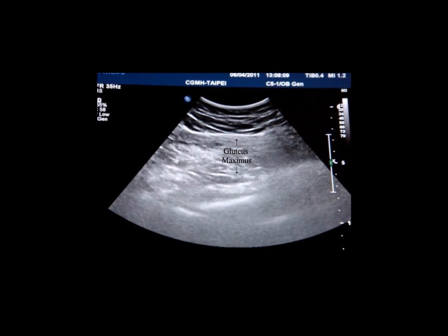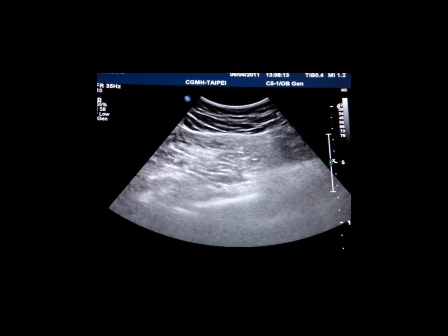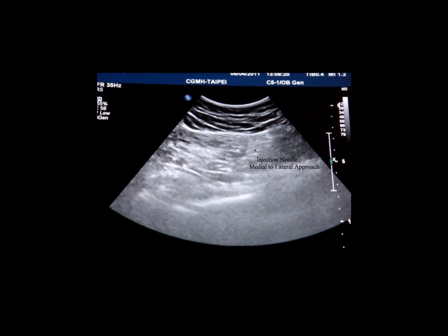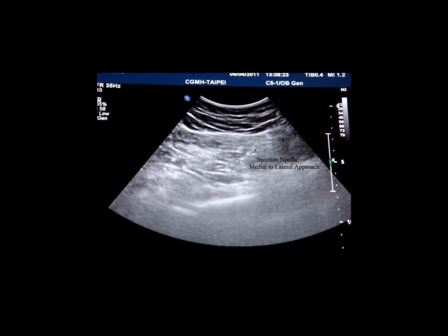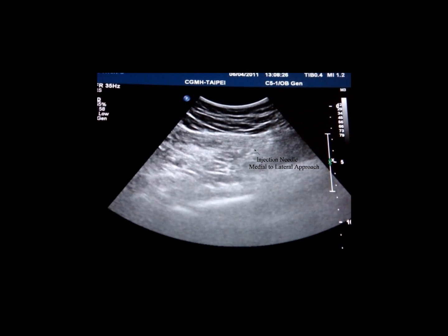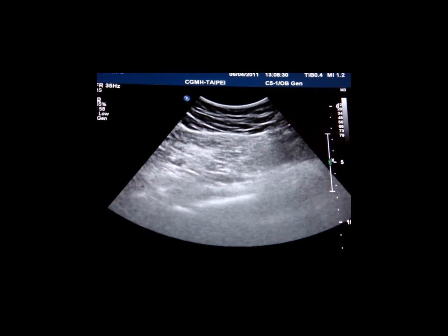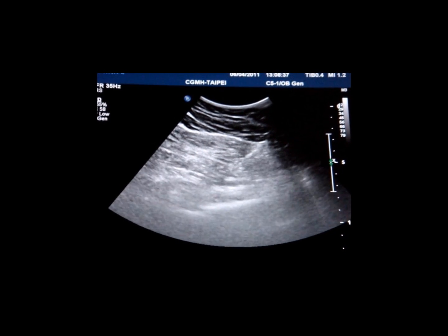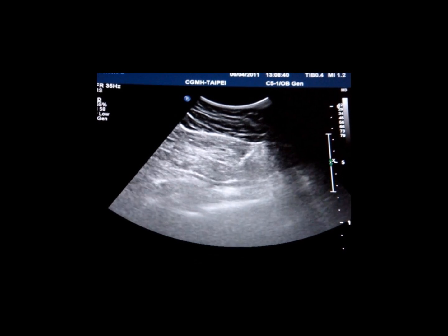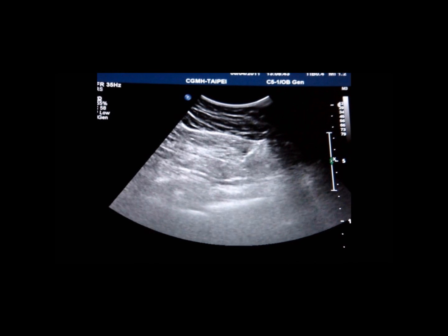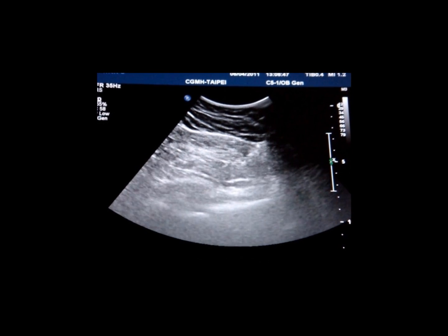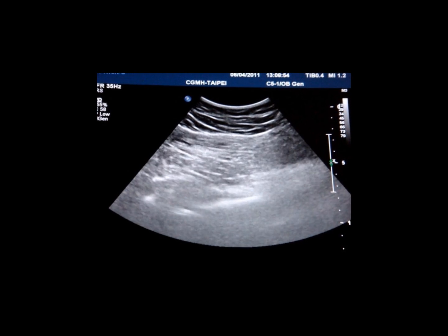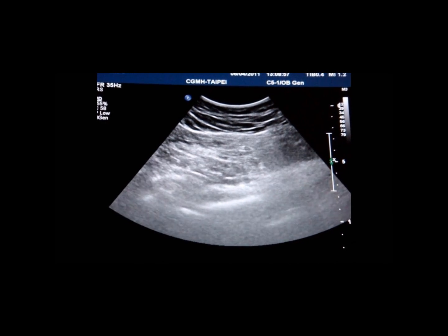We have now started our injection. The needle is approached from the medial side and now pierces through the gluteus maximus, as you can see here, and now enters the piriformis muscle. We now complete the injection of the piriformis muscle.